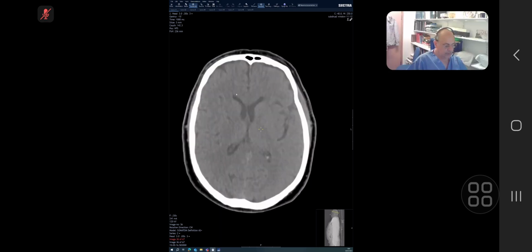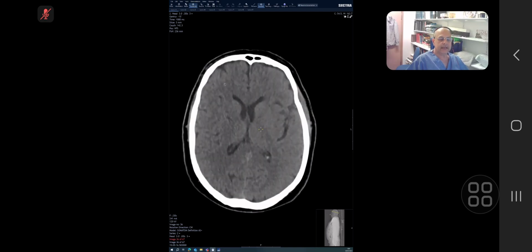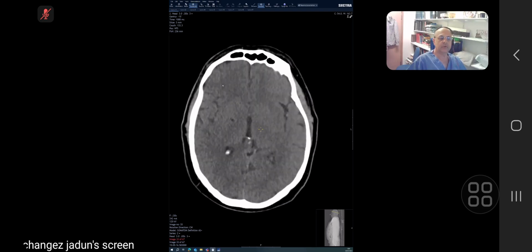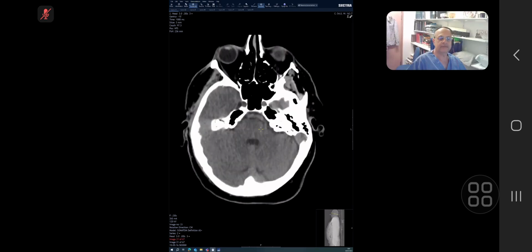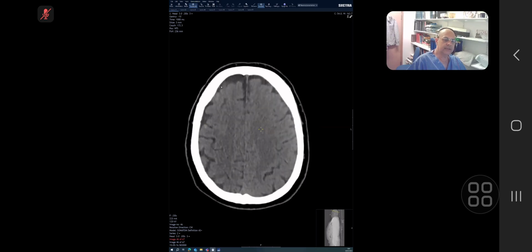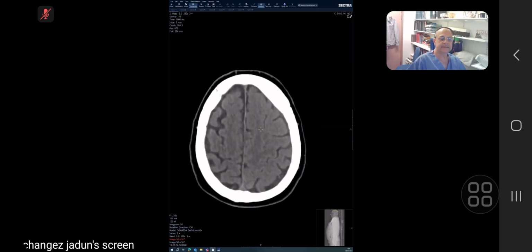Okay. So for the audience, candidate number one has not been able to pick up any bony fracture. So in a trauma series, he's right. You look at the parenchyma, you look for the bleed, and you look for the fracture. But do also keep in mind you need to look for any incidental finding that is there.